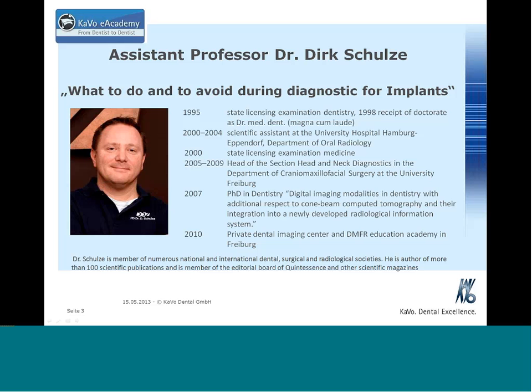I think, what would affect the vascular properties and therefore the healing? Maybe the sclerotic changes. Yeah, that's a nice question. But as far as I can say, when you check bone changes in MRI, you can see a lot of vascular changes. You can see edema, you can see change of the normal marrow pattern, and if you see any kind of these bone changes in MRI, I think a lot of people would avoid placing implants inside the bone because they don't know what will happen there.